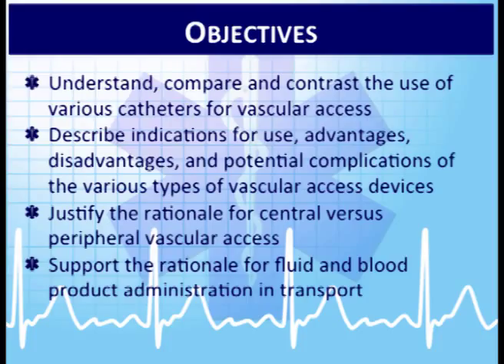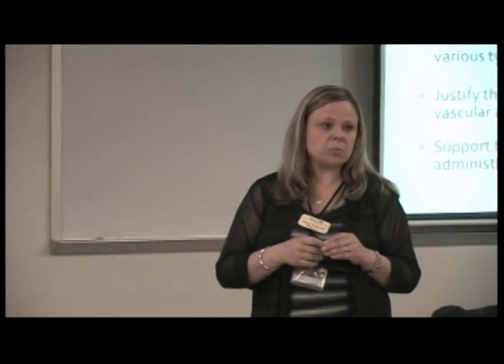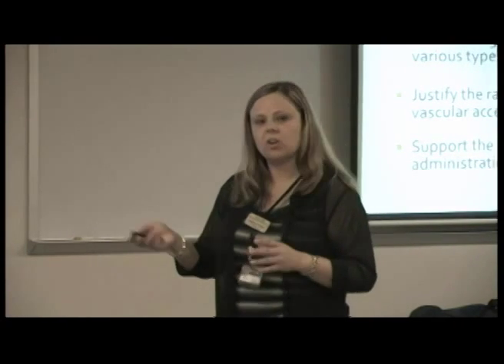Rationale for fluid and blood product administration. It's nice to know what can go through these lines, what rates can go through. As critical care paramedics, you are not starting blood transfusions in the field. However, it is in the curriculum, if it's approved by your medical director, to monitor blood products en route to the hospital. So that is something as critical care paramedics you may find yourself doing, along with a lot of different medications.